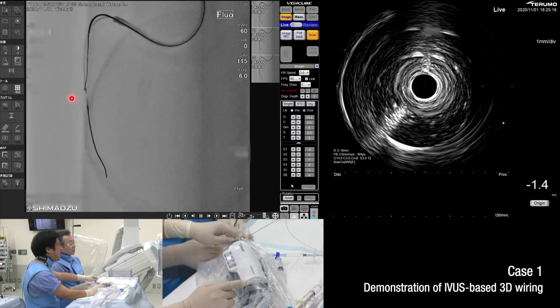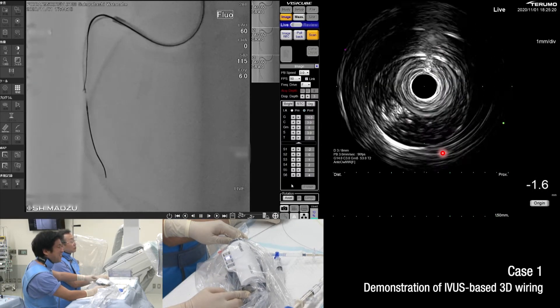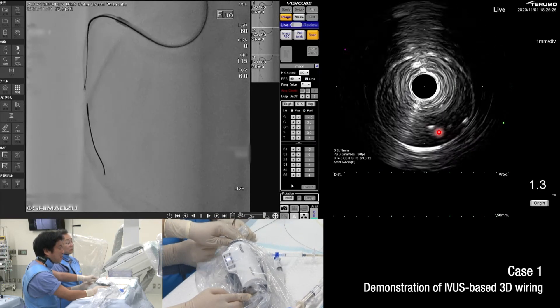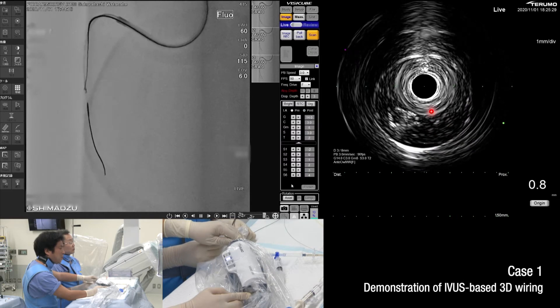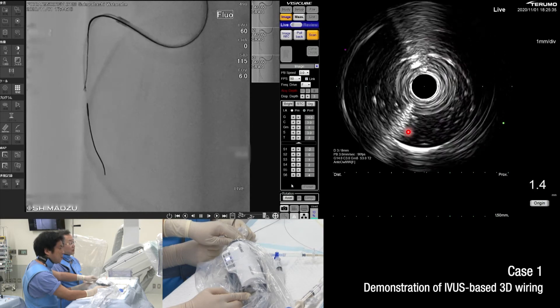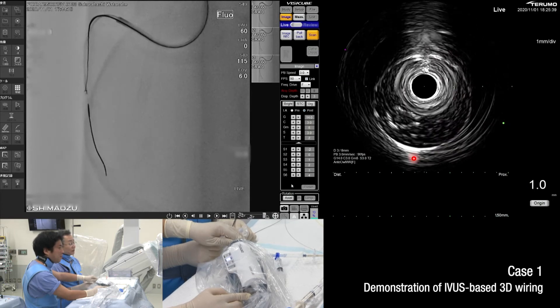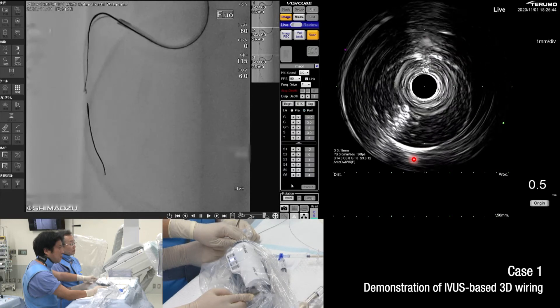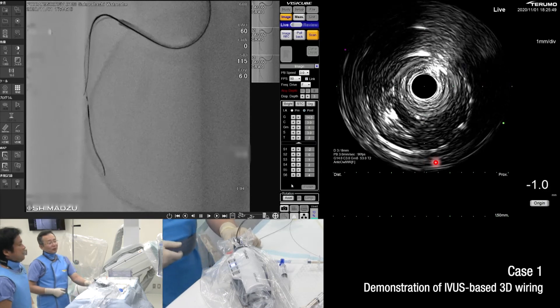Please advance the IVUS to check the distal part. We will check the tip. The tip is here. A little bit clockwise toward the center part of the target. You can now see where the target was and confirm placement.